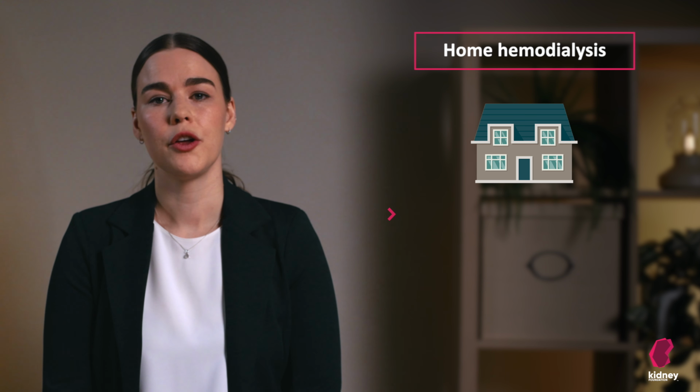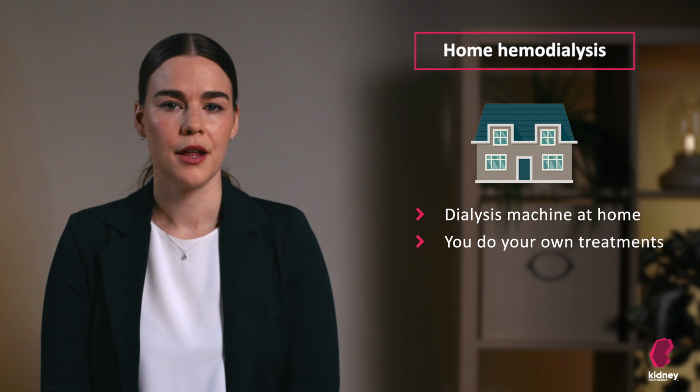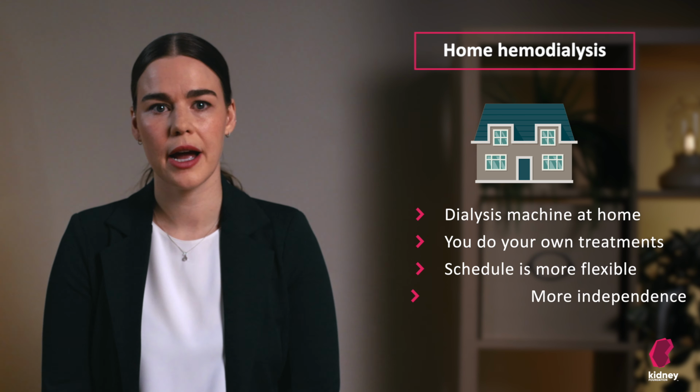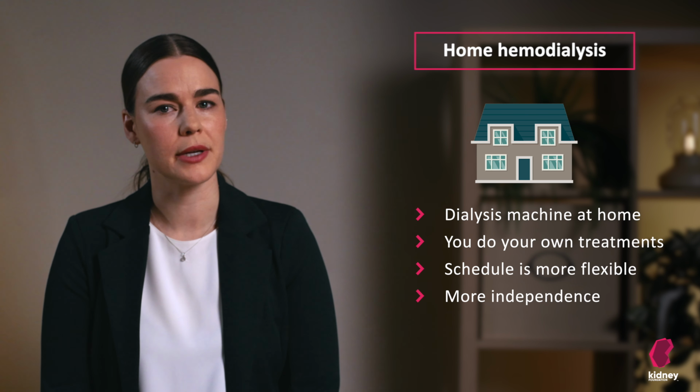Now we will talk about home hemodialysis. With home hemodialysis, you have a dialysis machine at home and you do your own treatments. The dialysis schedule is more flexible and you are more independent for treatments. You also have more responsibilities with this type of treatment.